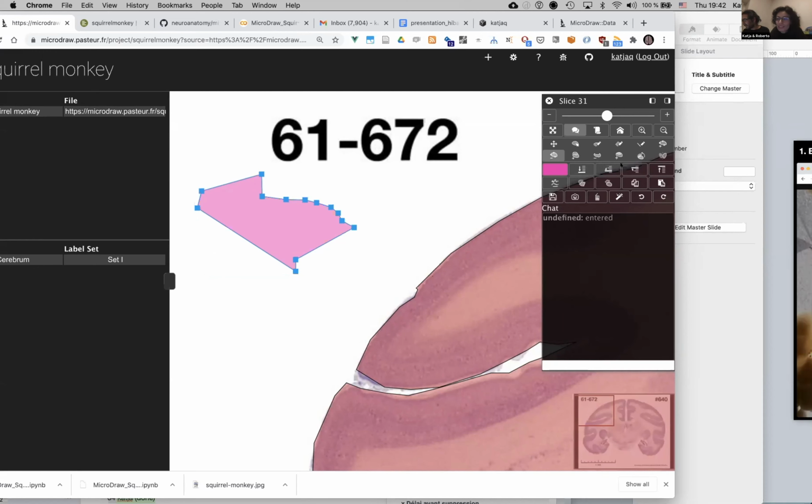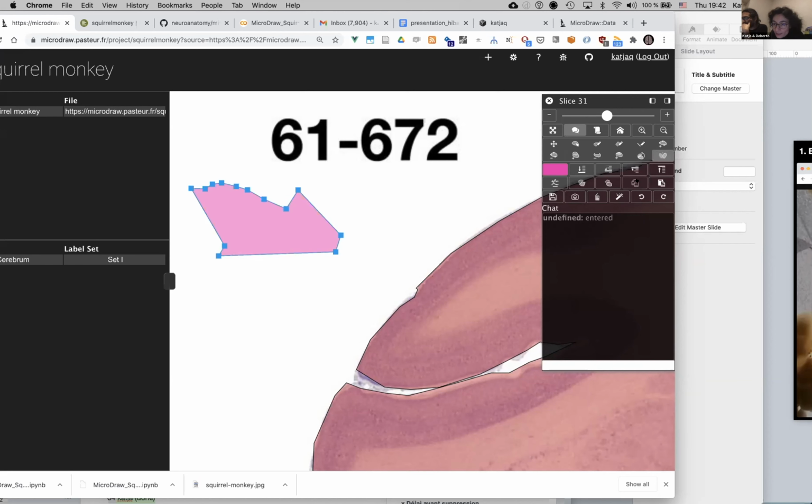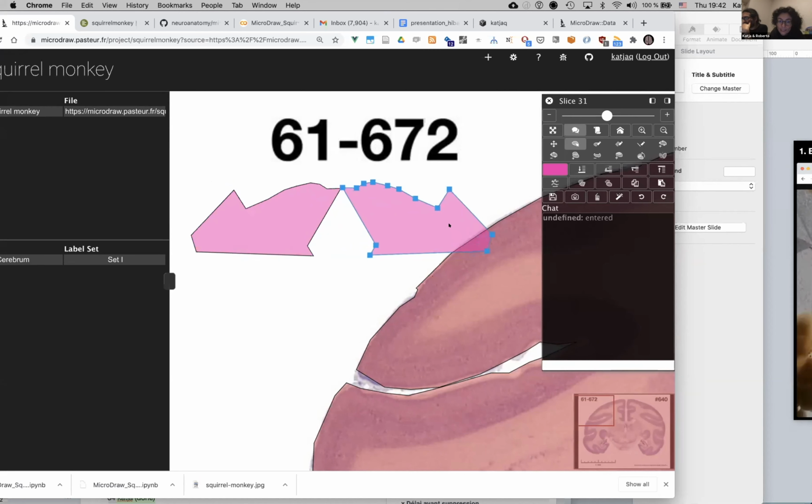What else can I show you? Yeah, it's nice. You can mirror and rotate regions. So if you want to rotate them, that can be handy. For example, you mirror from one brain region to the other, so you can copy it. In the first step, you copy the region, you paste the region. So now you have it twice, and then you can mirror it, and then you can displace it to the other brain hemisphere. Sometimes it's symmetric enough, it can work. And then you can adjust a little bit, but sometimes it works only for specific structures where there's not too much adjustment needed. Yeah.